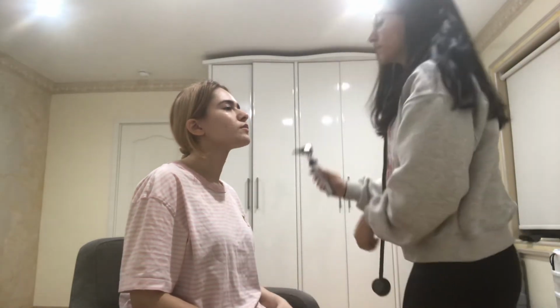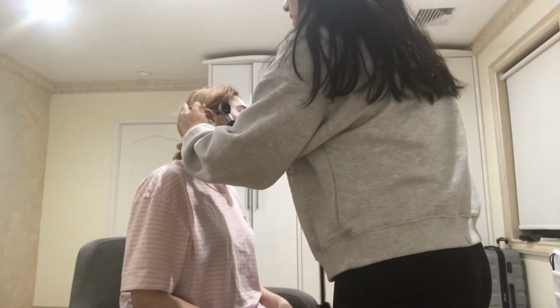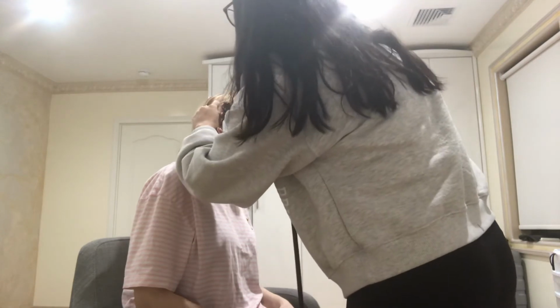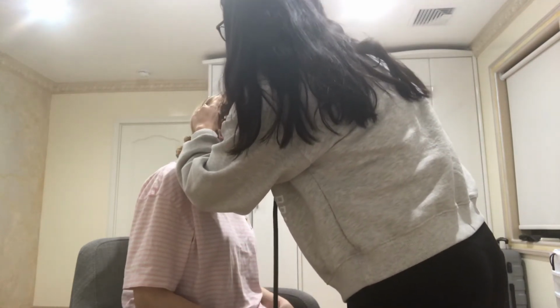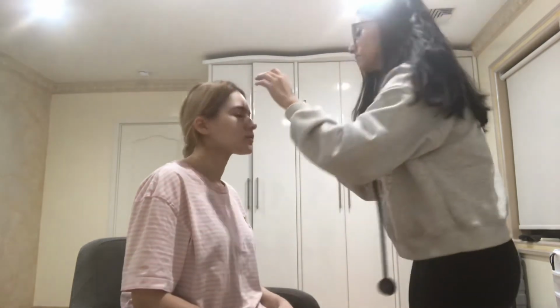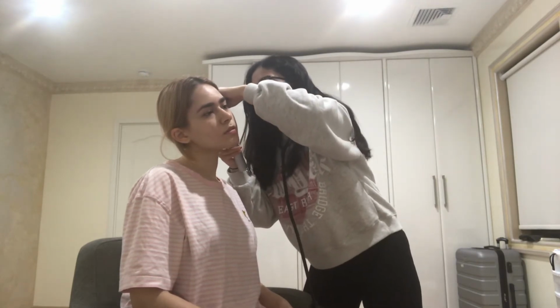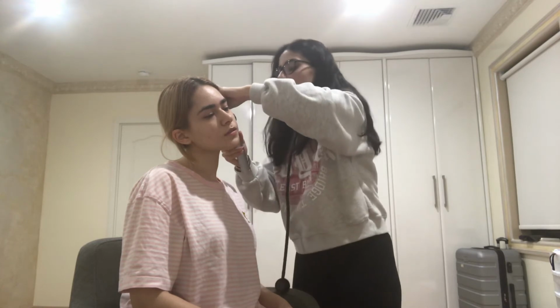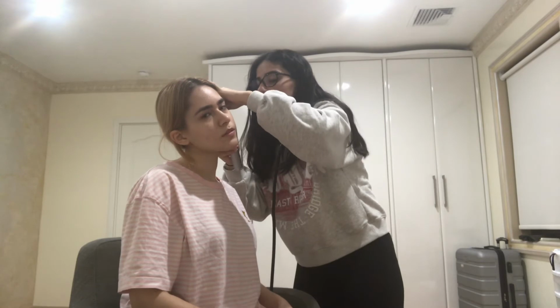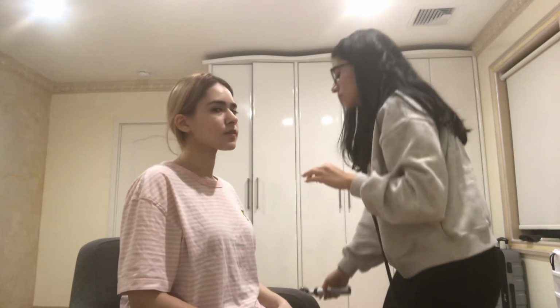Now I will do an internal examination of your ear by pulling the auricle up and back, and I will check for any erythema. No discoloration noted, no cerumen, no discharge. I have identified the cone of light and the malleus, which is gray, as well as the pars flaccida. No scarring or perforation noted.